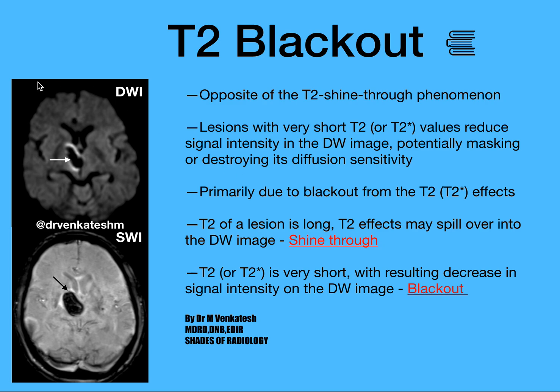Let us see with an example. This is a diffusion-weighted image. You can see a blackish signal here — it is completely hypointense, almost even more hypointense than CSF. So this is called T2 blackout.